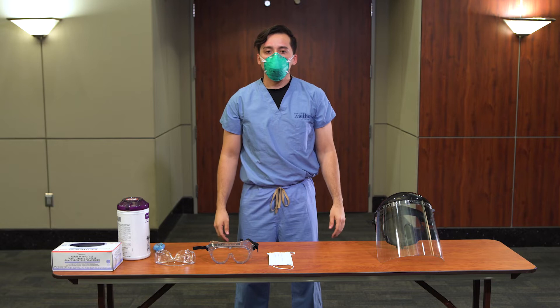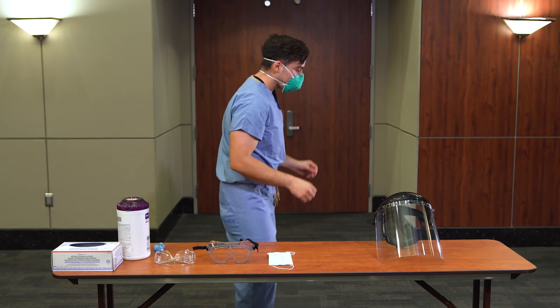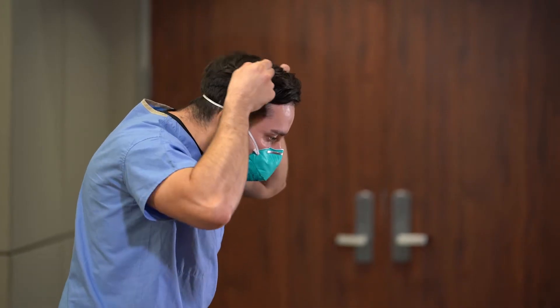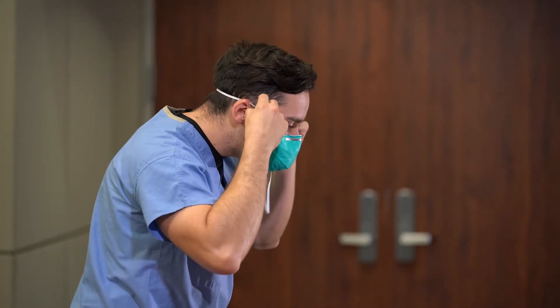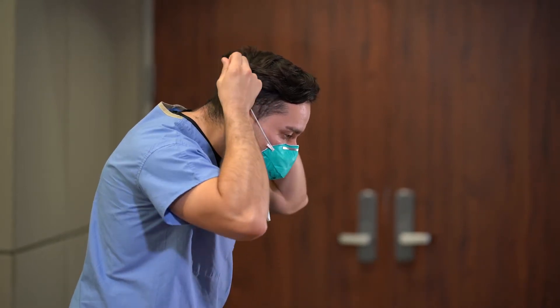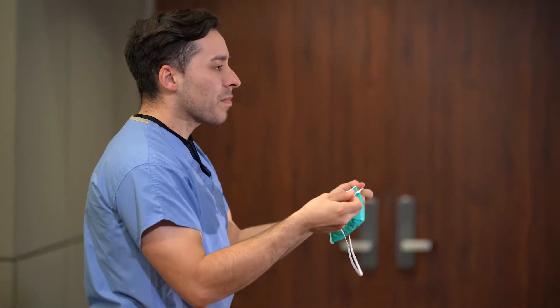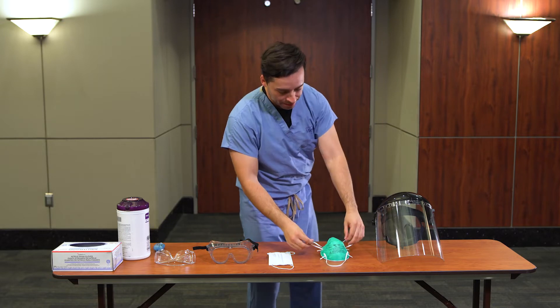Doff the N95 respirator by first tilting your head forward. Then use two hands to grab the bottom strap, pull to the sides, then over your head. Keep tension on the upper strap as you remove it, which will let the mask fall forward. Place the mask on a clean surface. Perform hand hygiene.